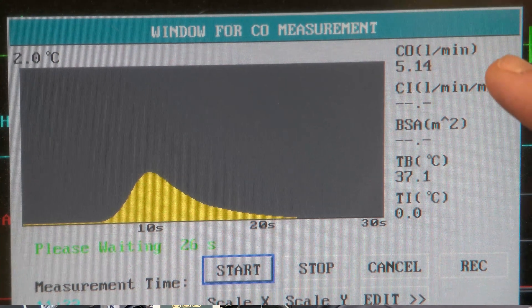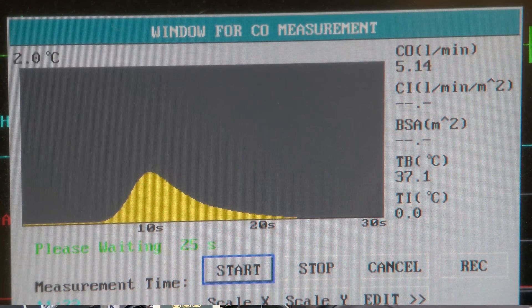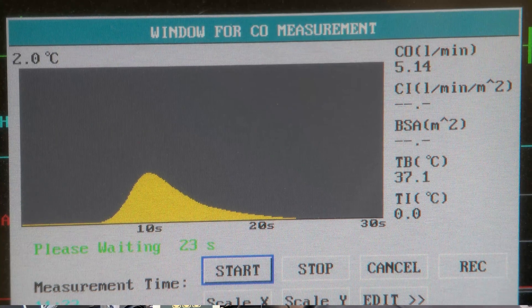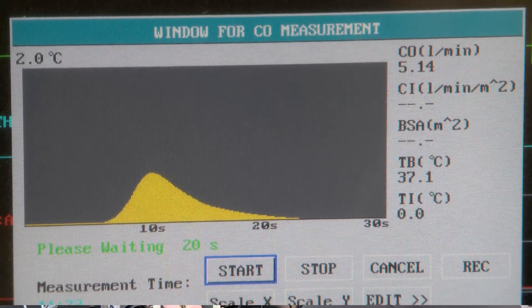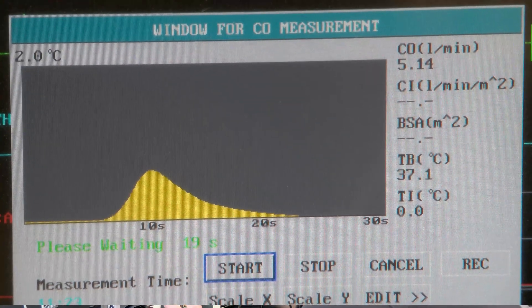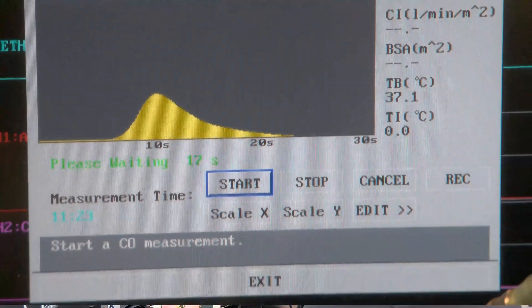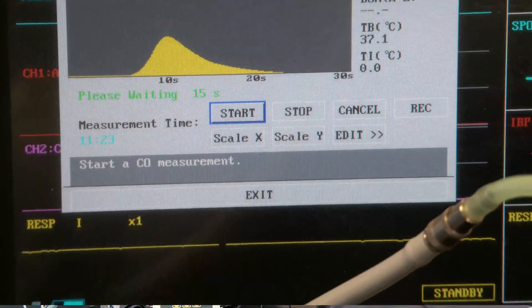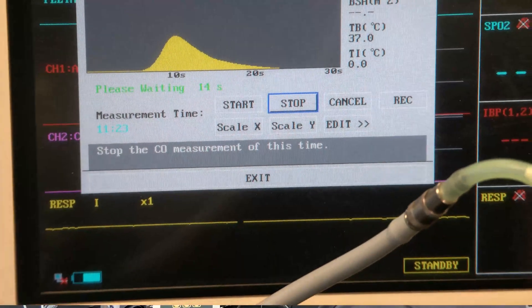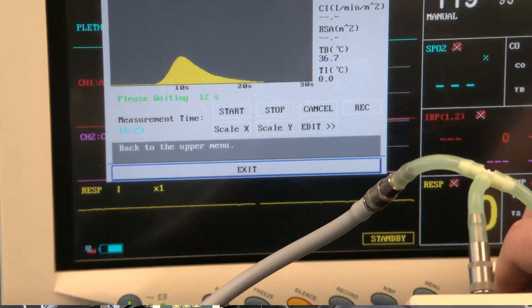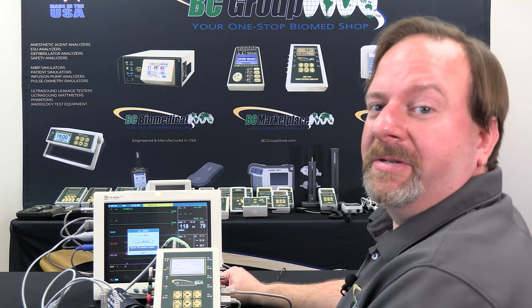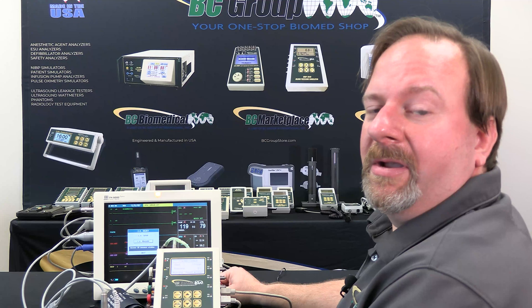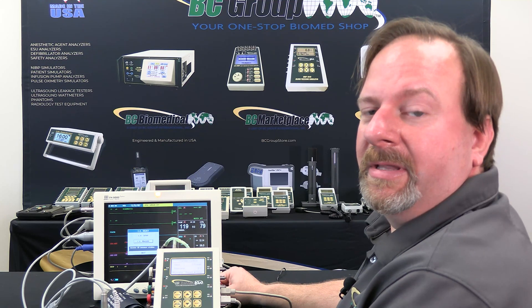In this case we got 5.14. We would check that against our service manual to make sure that that is within the calibration of the monitor. That concludes the features and functions of the cardiac output simulation using the NAVP-1040.